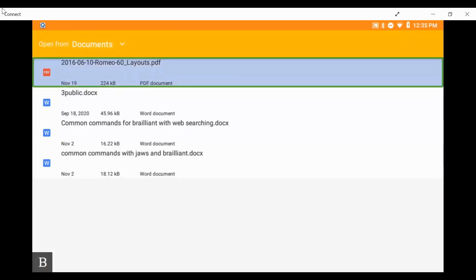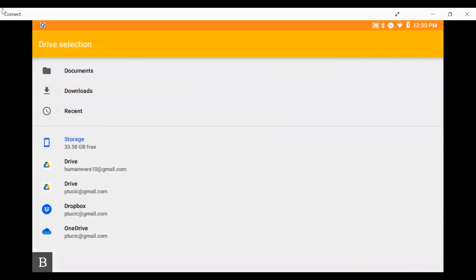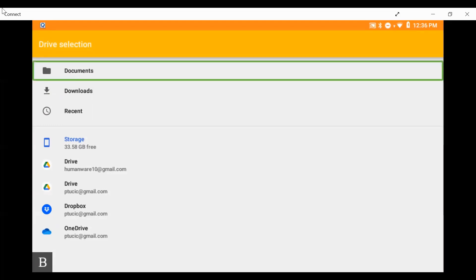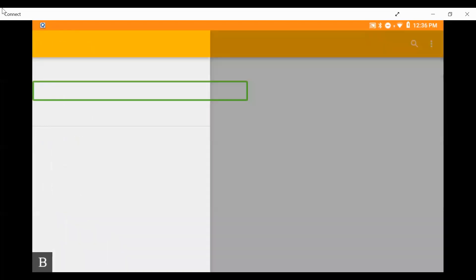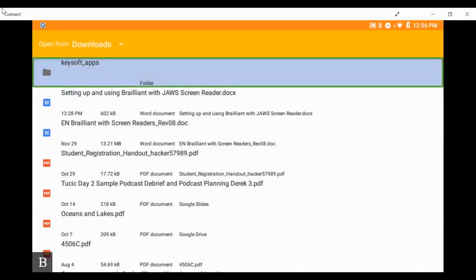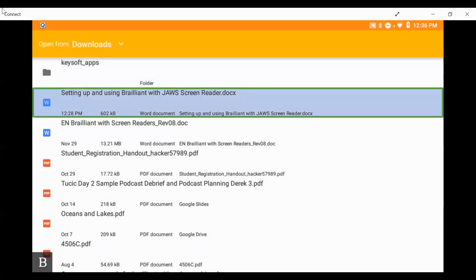Now we are in Key Files. Remember, to move to the proper folder we can press D with space to get to drive selection. Here we have all of our drives available. This document is in my downloads folder, which is actually pinned to drive selection, so I press D twice and Downloads is right here. I press enter to open Downloads and I'm placed in my downloads folder.